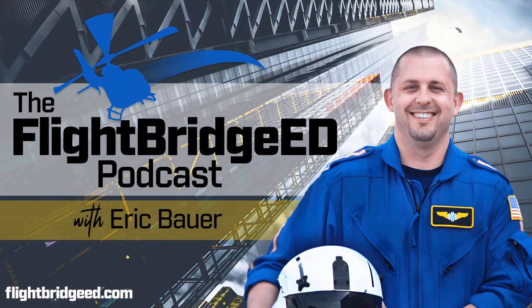So at this point, you're optimizing cardiac output. You're helping it along with those pressor drugs. You're trying to optimize oxygenation with a PEEP. And so how high do you go with a PEEP? Well, on this patient, I would keep going up. If you had online medical control or you had access to a physician, I would request to go up to 15, 20, 25 if needed.